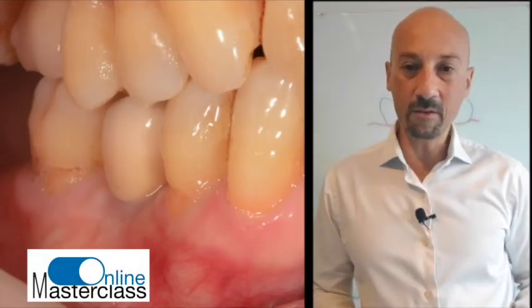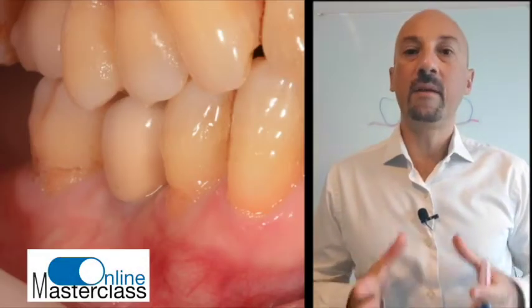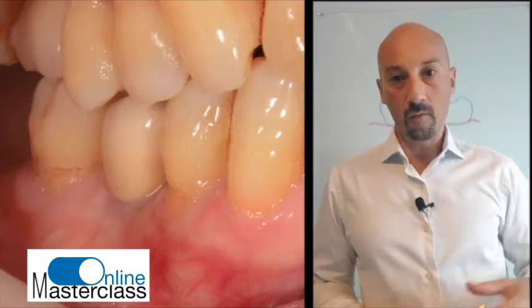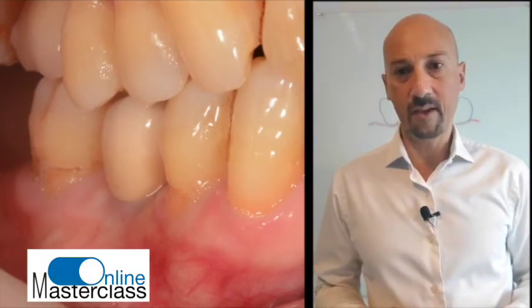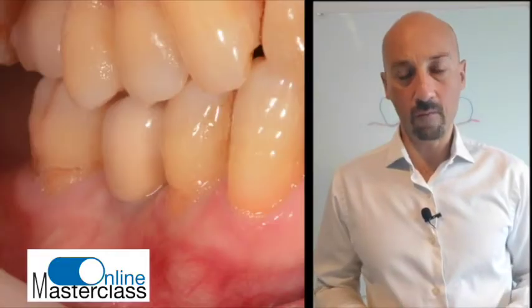Before we see some videos we have to understand a little bit the basic principles of this technique and the rationale behind the incisions, behind the suturing and what we're looking for.